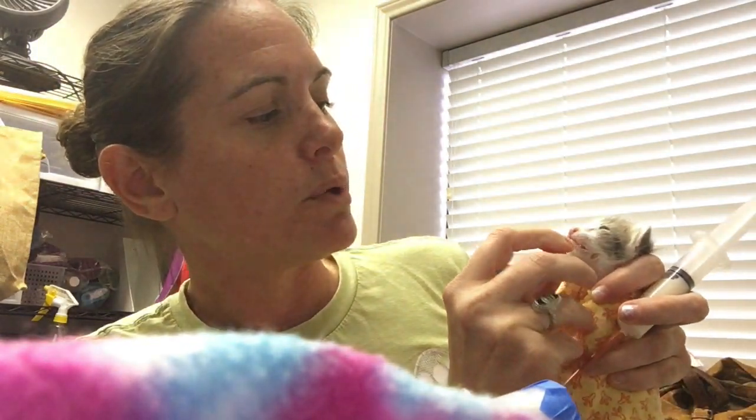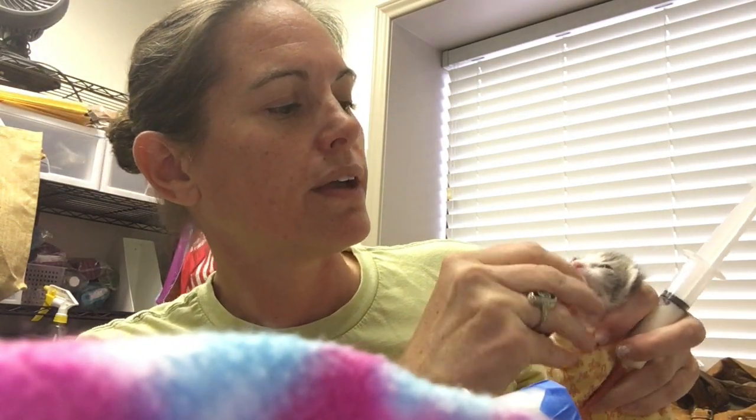Then I'm going to grab my tube. I'm going to go on the left side of the kitten's throat and go straight back — it should be able to slide right on down. You see how smooth that is? No jagged, no nothing. Your kitten should still be screaming, and that's good because that means it's not in their lungs. If it's in their lungs, you would not be able to hear any screaming at all.